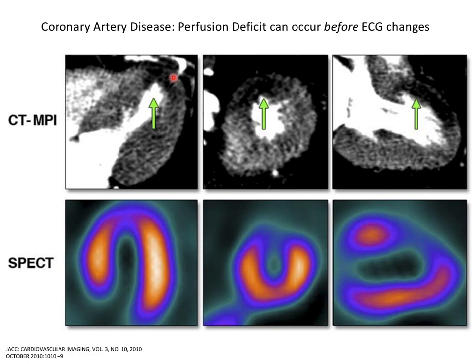The presumed reason is that the contrast agent that causes a bright signal in CT did not get there, because it had to get there through a coronary stenosis critical enough to stop flow. So the inference is that this big chunk on the anterior wall of the heart, where I'm not seeing contrast get in, is a perfusion deficit.